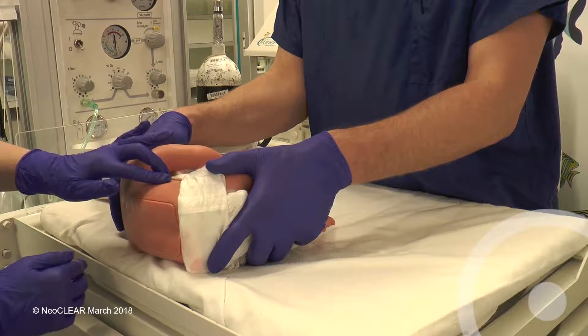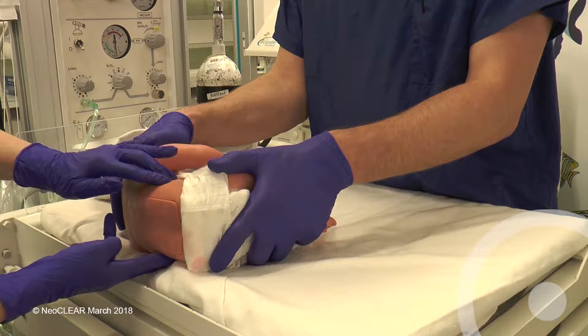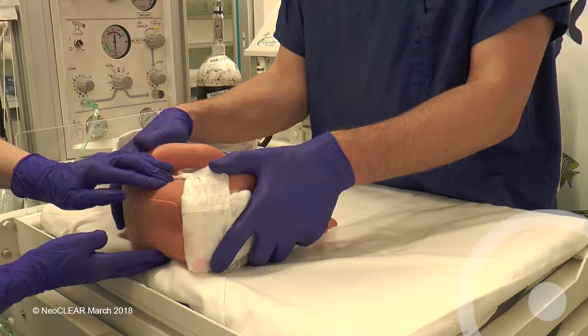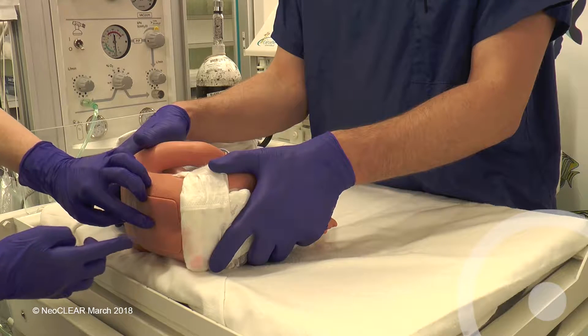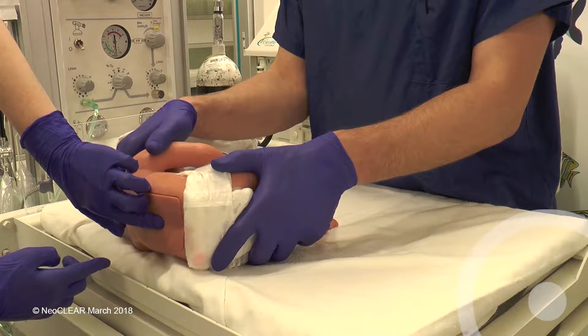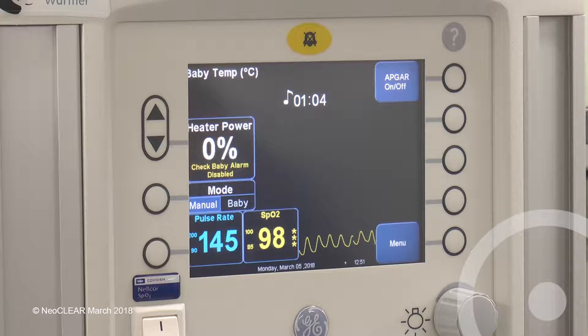The knees and hips should be flexed as much as possible. The hips and shoulders should be held firmly but do not over flex the neck. Feel for the top of the iliac crest on each side. Just below the intercrystal line should be the L4-5 space. The second assistant should be checking the monitor throughout for the lowest and highest heart rate and for the lowest SATs with a reliable trace. The procedure can be stopped or paused if the baby is felt to be compromised.